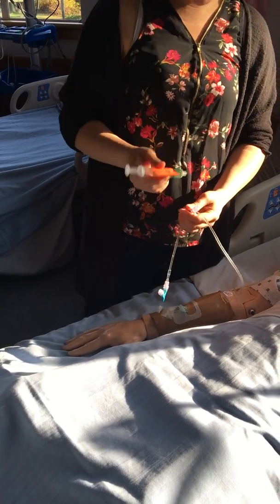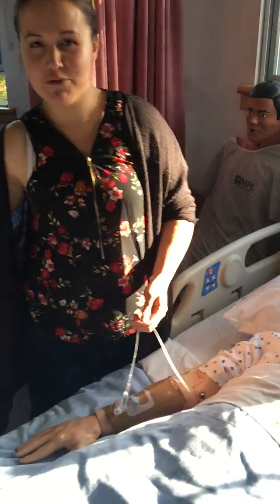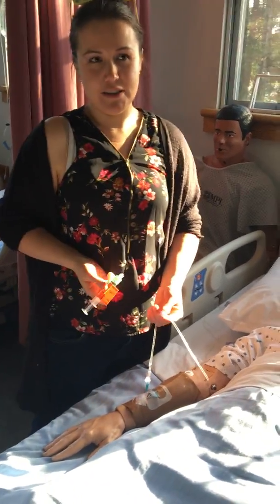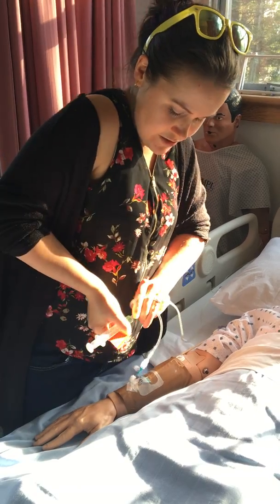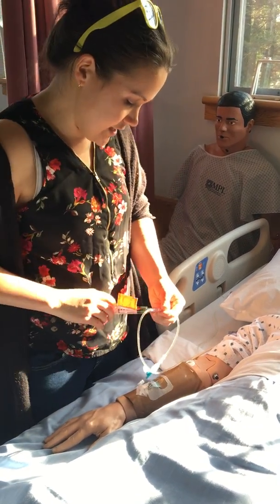oh, okay. So I let go of this, I touched my finger. If I did that in real life, I would go and I would redraw up the medication because I've broken sterility. But for the purpose of this video, let's pretend I did not break sterility. Okay, so I'm going to connect this using a clean technique, a no-touch technique.